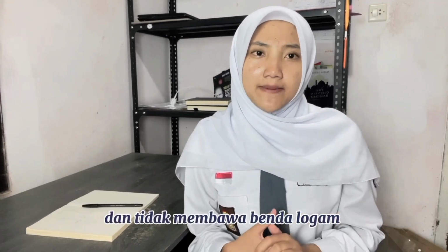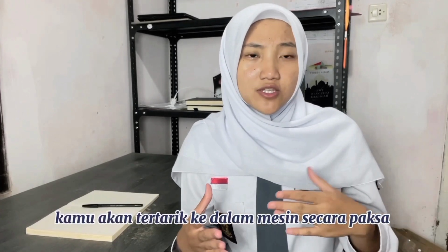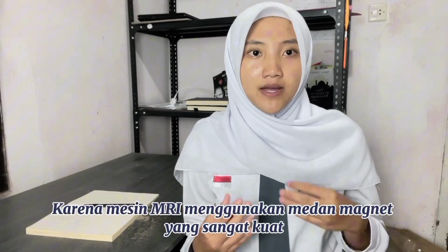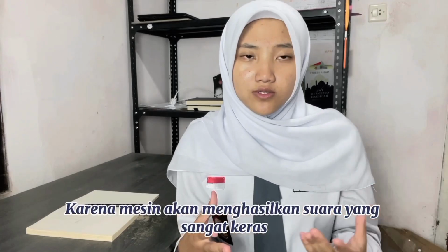During an MRI scan, we must remain completely still for 15 to 90 minutes and not bring any metal or electronic objects into the room, because if you do, you will be pulled into the machine by force. Because MRI uses a very strong magnetic field, and usually our ears will be covered because the machine produces very loud noises.